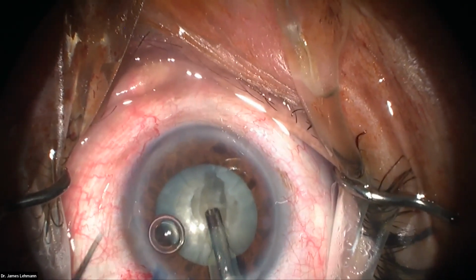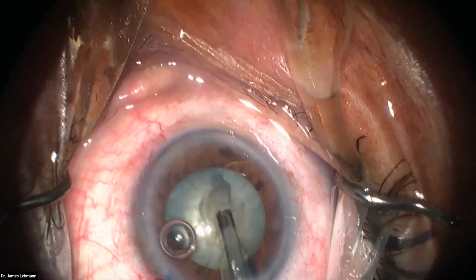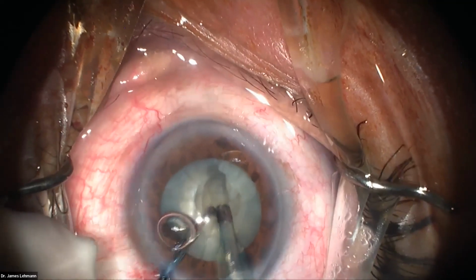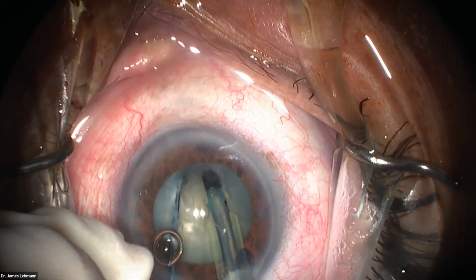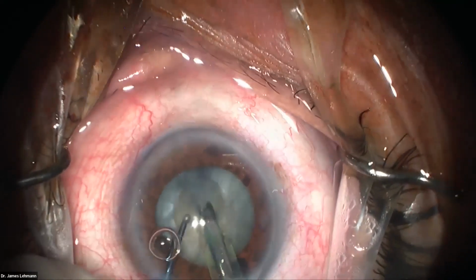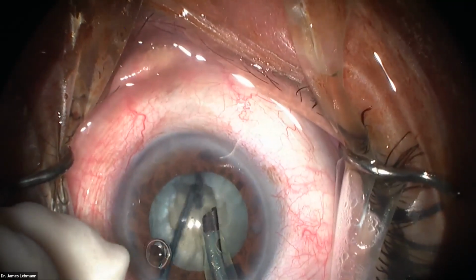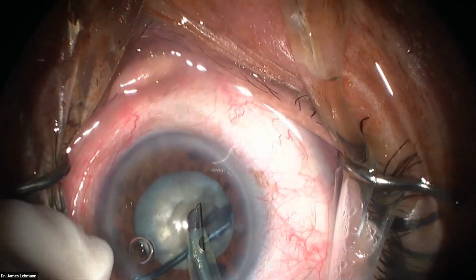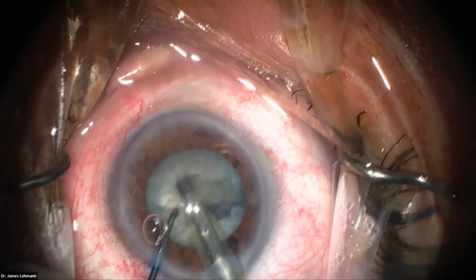Now I'm going to put in my second instrument, which is just a horizontal chopper. You can see it's blunt at the tip. Go through my paracentesis. And then I'm going to try to crack. So we got a good crack there. You see that? Now I'm going to eat some of that. So you can look at the depth. Maybe we're about 80% right there. So that's good. And now I'm going to rotate. That helps to guide you on the next grooves because you know what the depth is. So we're going to start at the top here.